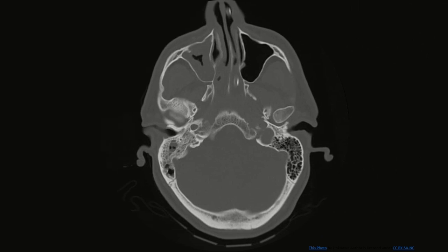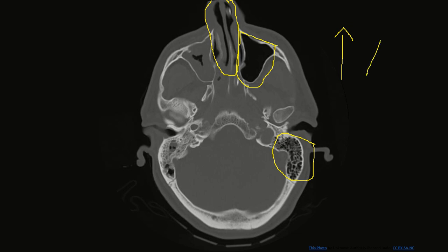Let's use this section to orient anterior and posterior. Can you see these black spaces at the back? Those are the mastoid air cells. Up here, these slits represent the nasal cavity, and this is the maxillary sinus. The direction facing the nasal cavity and maxillary sinus is anterior, and the direction facing the mastoid air cells is posterior — simple as that.